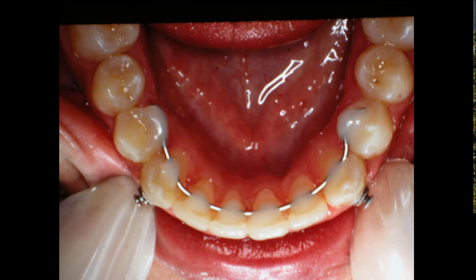All right, there it is, looking from the top. Put your rubber band on that. Go back up to your retainer, or actually hook it on your retainer and then bend it down here. You can hook your elastic on the retainer before you put it in if you want to.